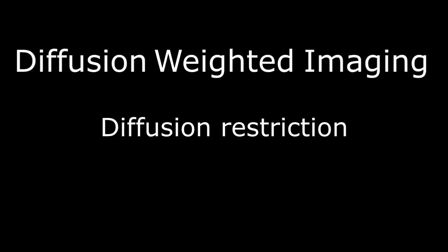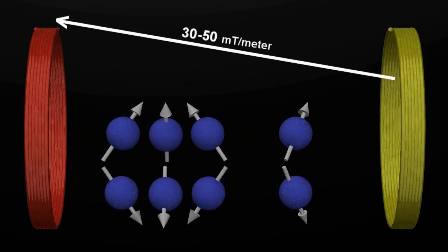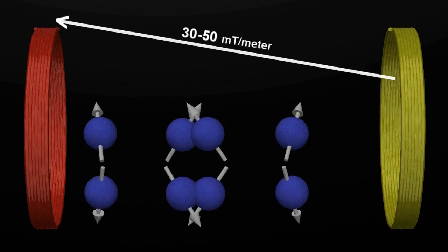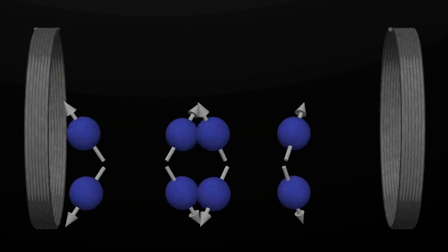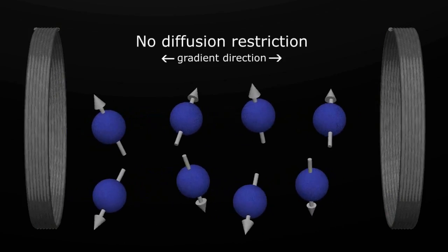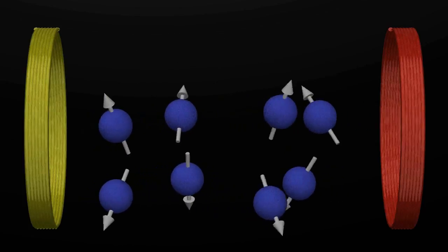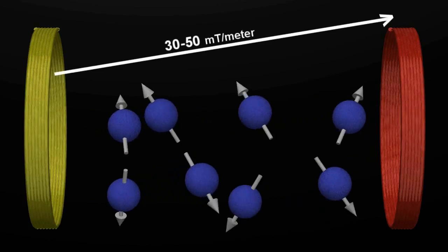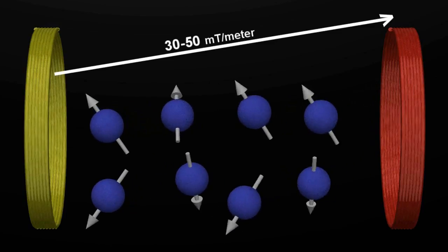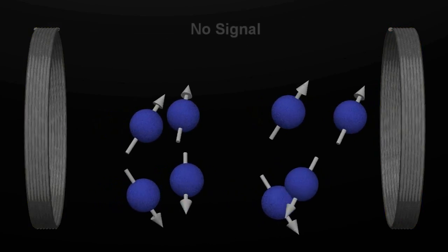Diffusion weighted imaging is used to determine if there is diffusion restriction or limited molecular movement in regional tissues. This analysis is performed with identical but opposite strong magnetic gradients applied sequentially after the radio frequency pulse. If there is normal Brownian motion or no diffusion restriction along the direction of the applied gradient, the hydrogen protons in the molecules will move in between the two pulses and therefore will dephase or not spin together, weakening the NMR signal.